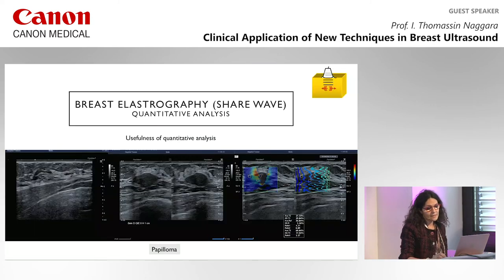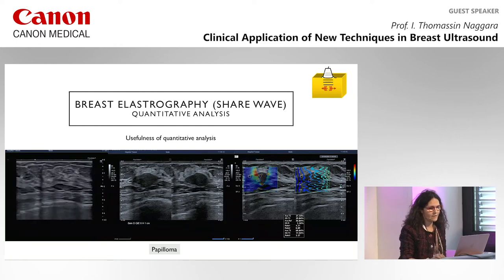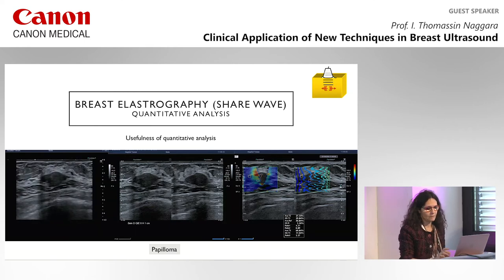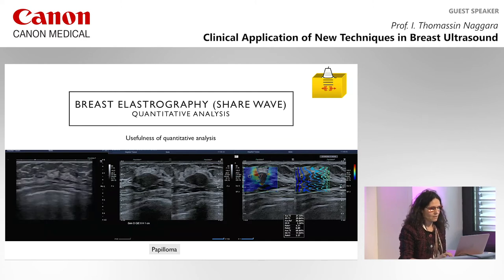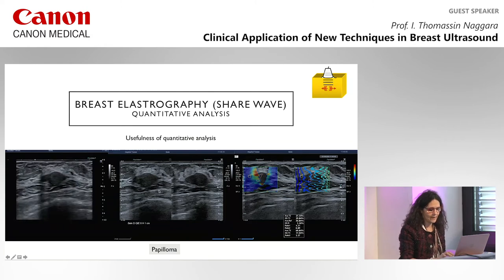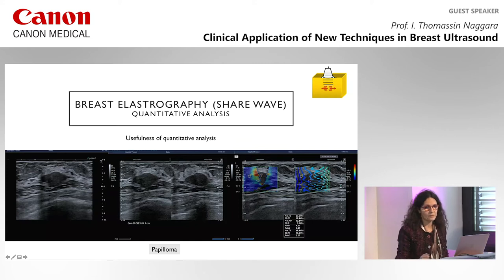It is interesting to use quantitative analysis for elastography, because sometimes you can have artifacts in the wave description, and quantitative analysis is probably more robust. In this example the patient has a mass, and looking at the elastography there is a modification of stiffness with ratios between 2 and 4. It's important to make several regions of interest because lesions can be heterogeneous. This lesion was a papilloma.